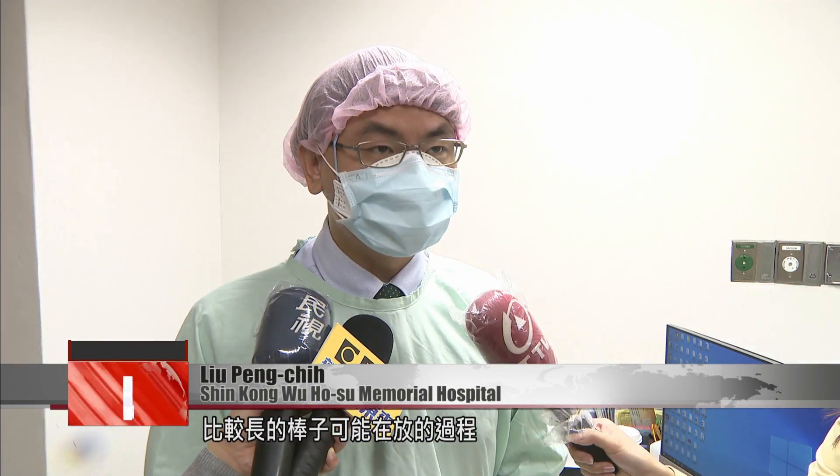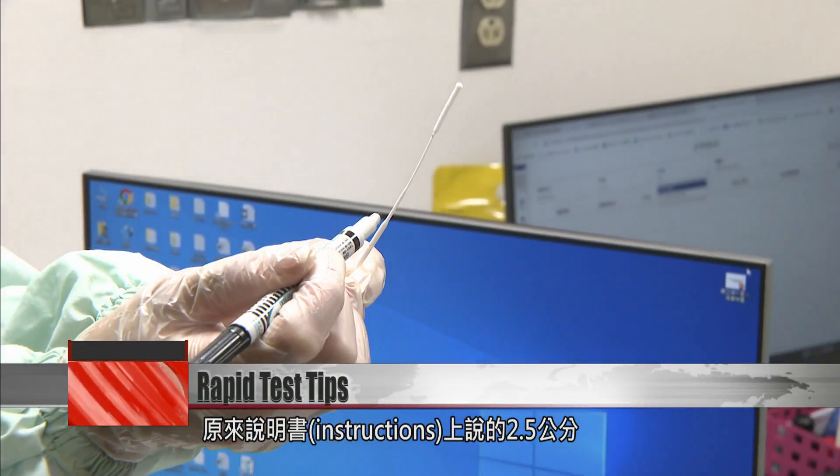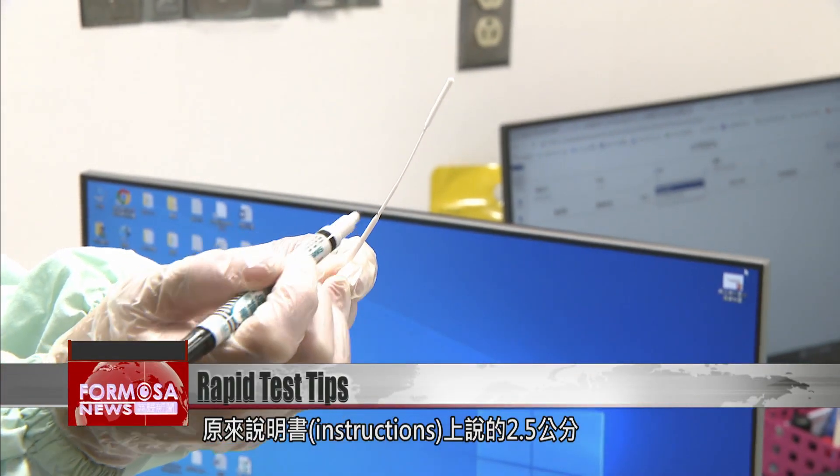If the swab is longer and you flinch while inserting it, the swab could break. If, after you pull it out, there are barely any secretions on the swab, it could be that it didn't go deep enough.